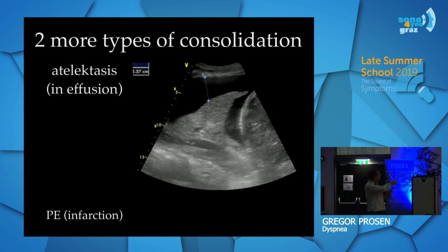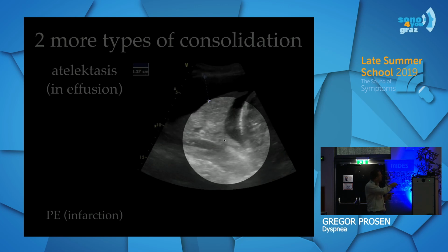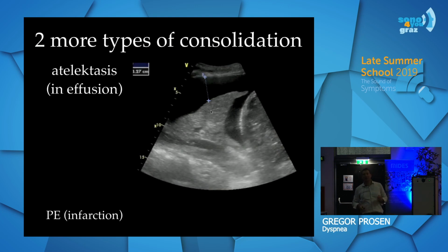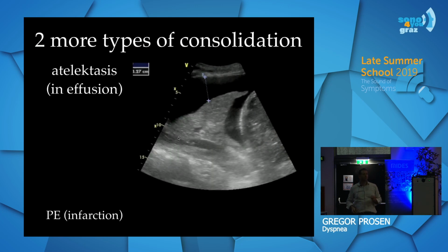And as you see, there is a lot of fluid around it, diaphragm, and this is atelectatic, probably left lung. How do I know it's left lung? Because pay attention. You see this hose here, and it was pulsating. What was that? It was actually thoracic aorta.